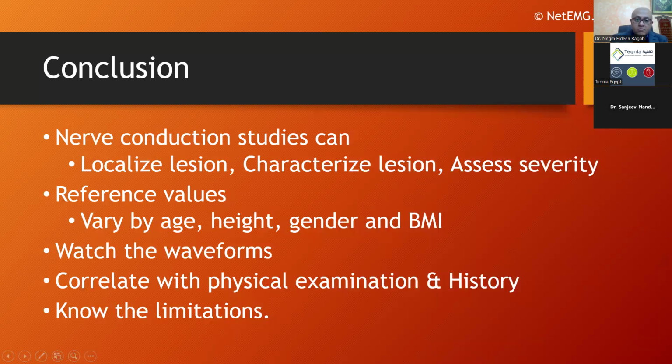So those are the two strategies to assess the normality of F responses by taking into account the patient's height. But you're absolutely right. If you're going to assess F wave recordings, either compare the latencies based upon the height, or calculate the velocity and relate it to the patient's age and the distal conduction velocities.